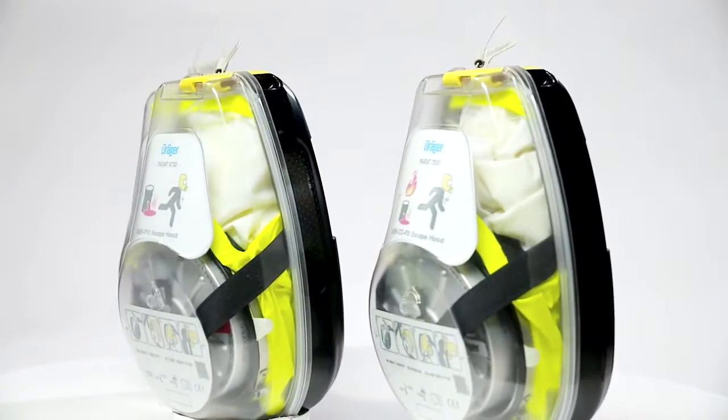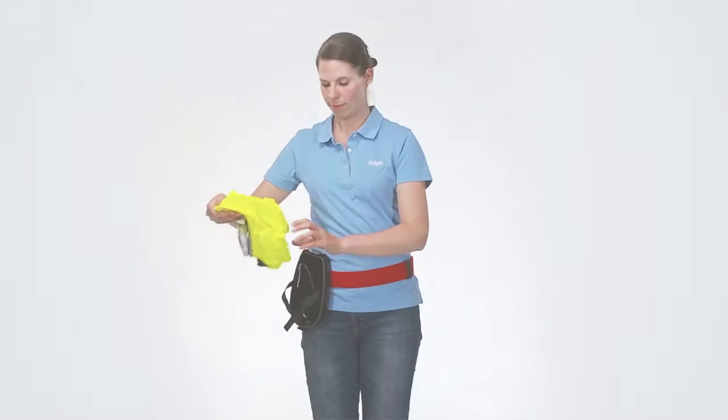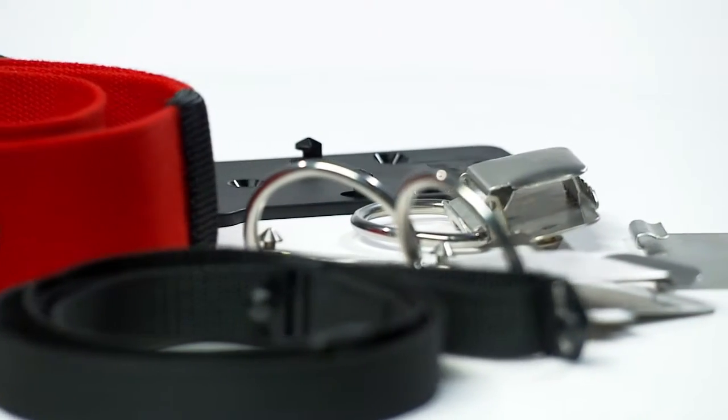This video gives you detailed information on the following topics: how to use the Draeger-Parat escape hood in the hard case packaging, how to replace the filter, and the carrying options of the Draeger-Parat escape hood.